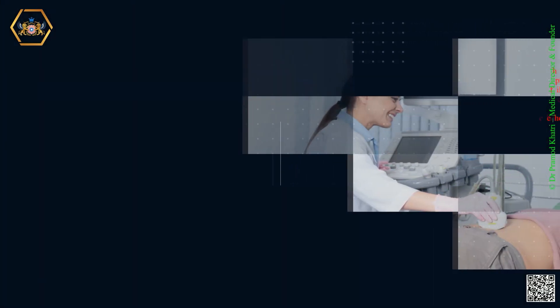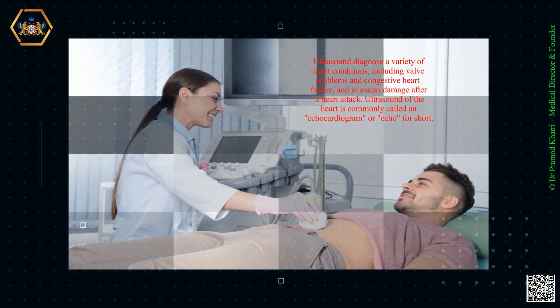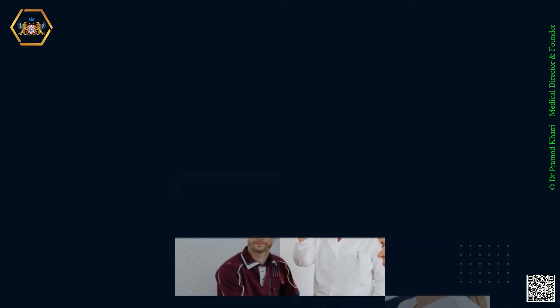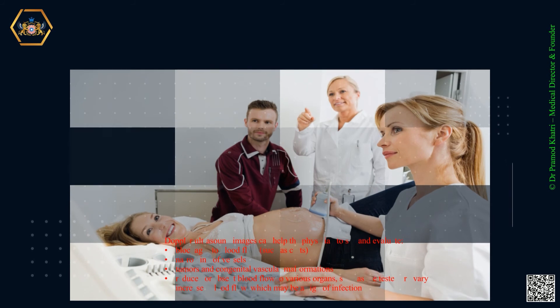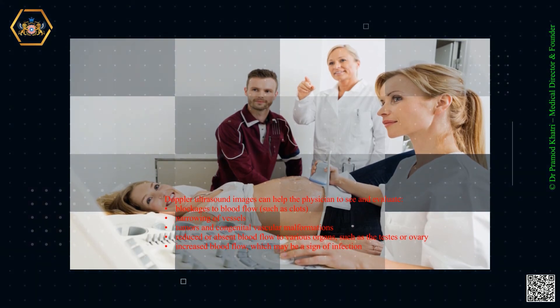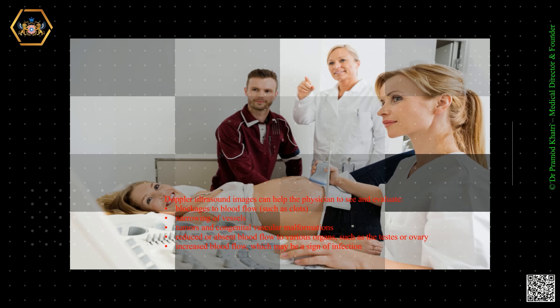Ultrasound can diagnose a variety of heart conditions, including valve problems and congestive heart failure, and assess damage after a heart attack. Ultrasound of the heart is commonly called an echocardiogram, or echo for short. Doppler ultrasound images can help the physician see and evaluate blockages to blood flow such as clots, narrowing of vessels, tumors and congenital vascular malformations, reduced or absent blood flow to various organs such as the testes or ovary, and increased blood flow, which may be a sign of infection.